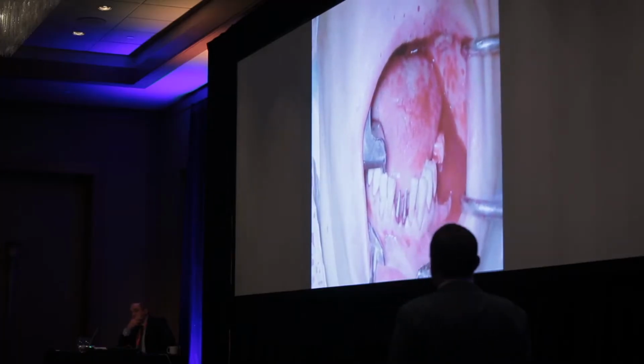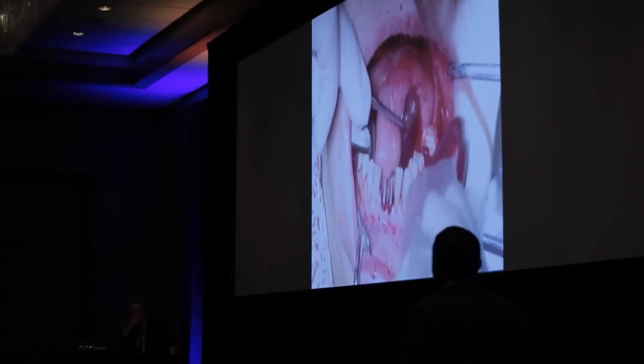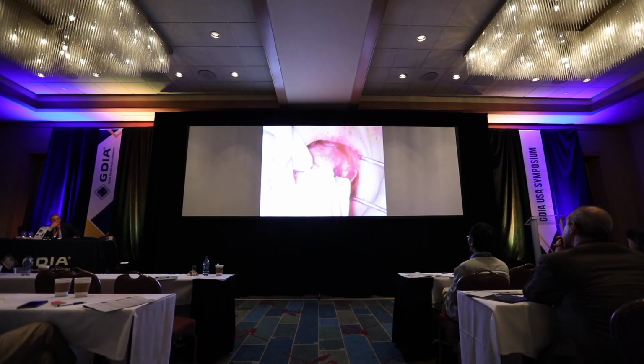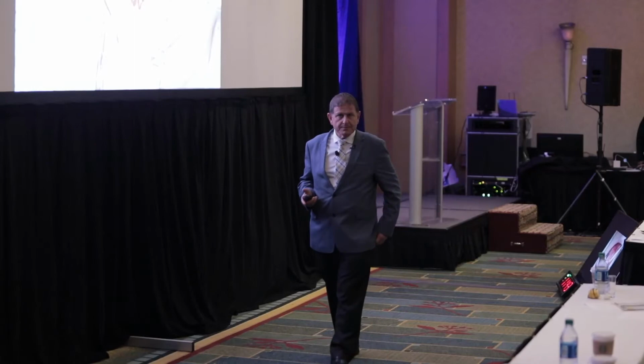So I took a video of the other part of this nice lady, and you can see the bleeding here, and in a few seconds, you're going to see the splash of the artery on the finger of my assistant. Take a look now. We eject the material into the site, press it firmly for 3 seconds, and stop the bleeding. Now, we need to understand that when we work with cement, we need to work with it as a bulk. We cannot take it a little bit and a little bit like granules. It would not work. So change your way of thinking when you're working with cement.